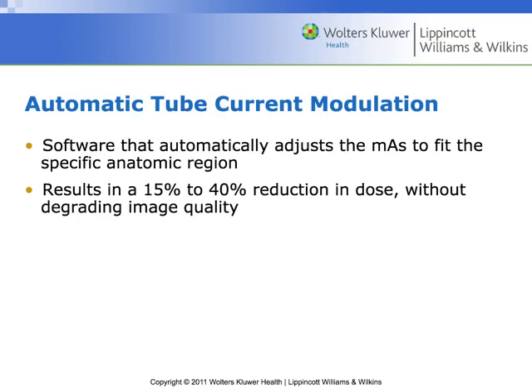But what this is basically allowing the technologist to do is to match MA to a noise level, right? So what I mentioned earlier is I can drop MA and get you crappy pictures all day long. The reason those pictures are crappy is because they have a lot of noise, right? So what we can do instead is to say, here's a range of energies I want you to use, machine. I want you to use this range of energies, and if the images start to get too noisy, crank up the juice and make them less noisy, right? And then if there's plenty of signal there, crank it down some, right? And so we call that automatic tube current modulation.